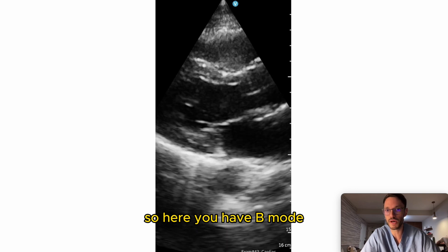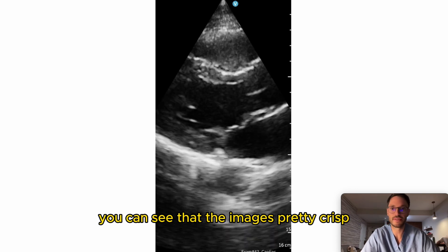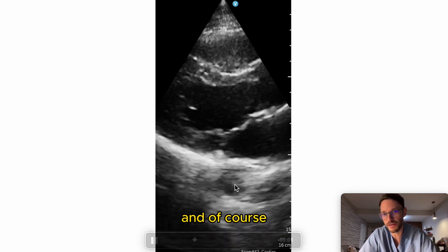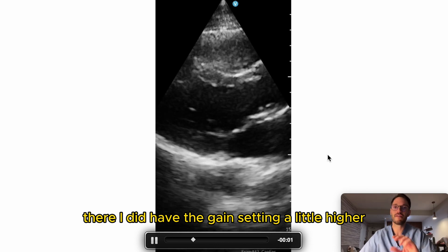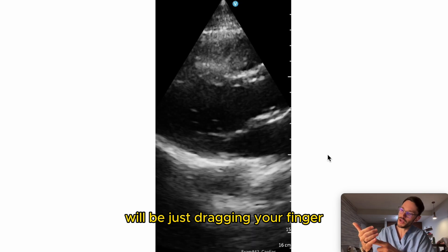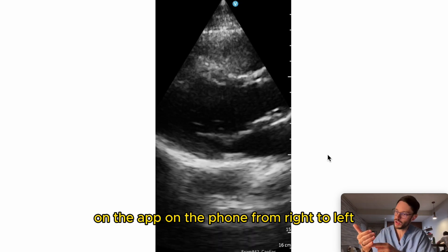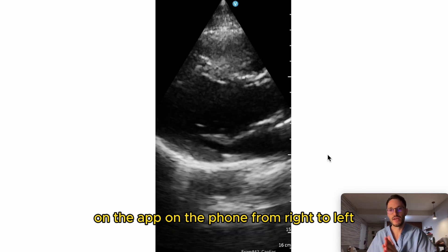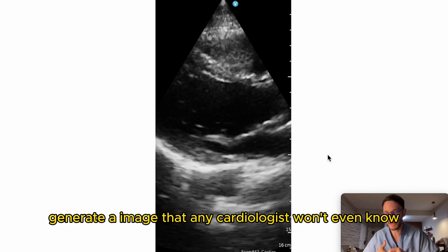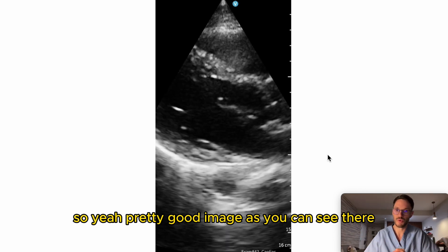Here you have B-mode — this is a long axis parasternal view. You can see the image is pretty crisp and clear. The gain setting was a little higher here; to reduce it, just drag your finger on the app from right to left. That generates an image that any cardiologist won't even know which device you used to get it.